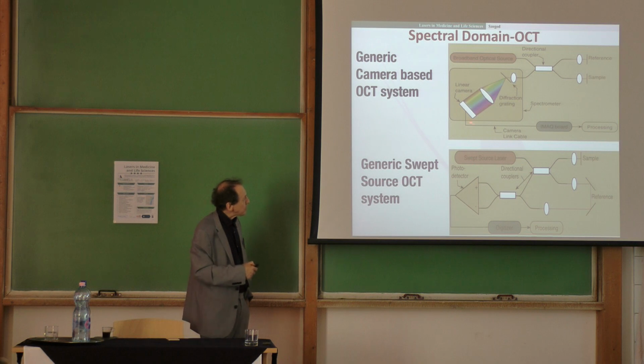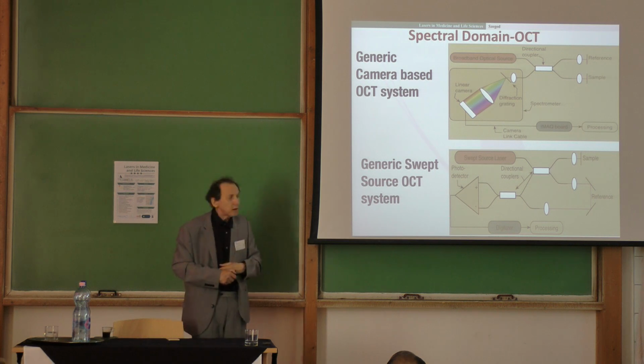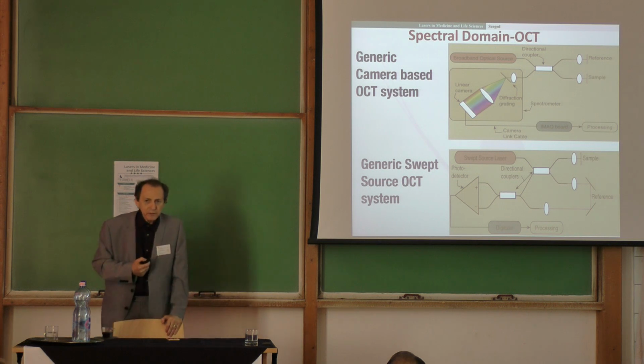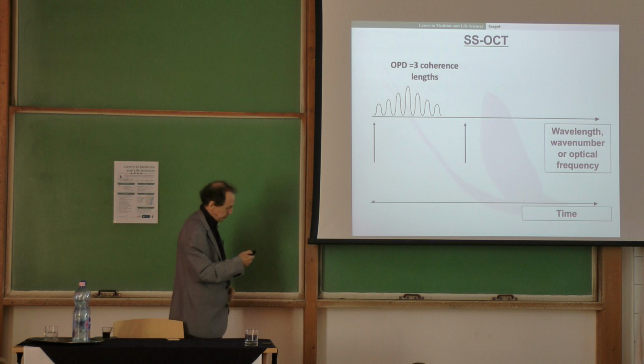Because in this spectrum you practically sweep, you move that Dirac delta function, that very sharp wavelength, in the spectrum. And what you collect here in time is practically the spectrum. So the signal which you collect from the camera is practically the same electrical signal here. So this signal is exactly equivalent. That's why they may be seen as so different, but in fact the physics is the same, because the electrical signal here and here is the same. Let me tell you more about this.